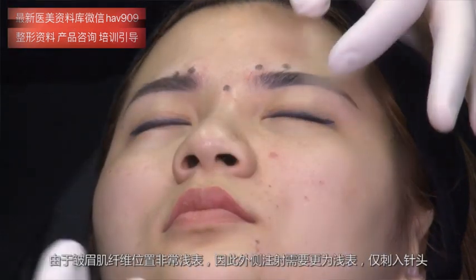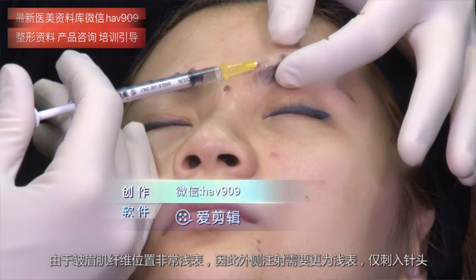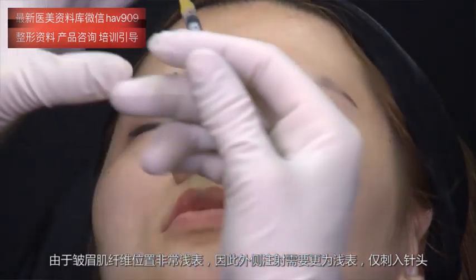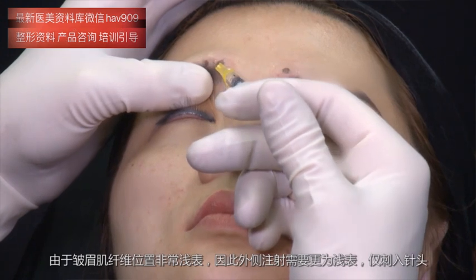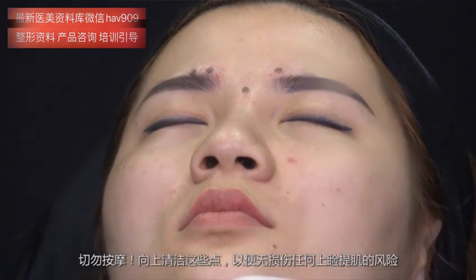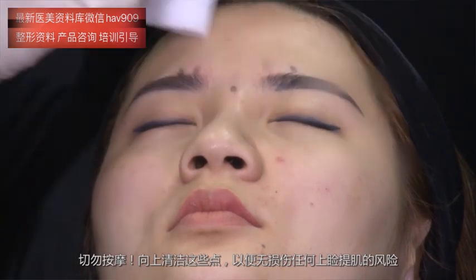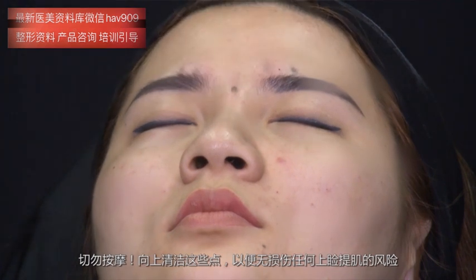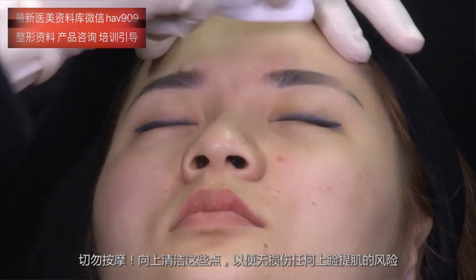The lateral must be more superficial, so we penetrate just the tip of the needle, because the fibers of corrugator are more superficially. Very important is no massage. Clean the dots upwards so that there is no risk of compromising any levator.